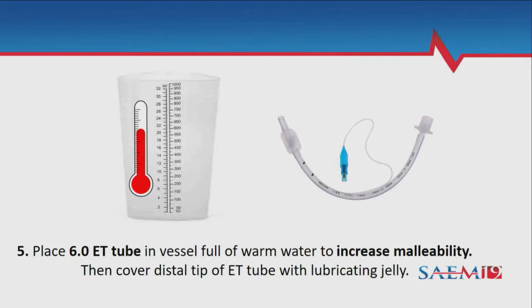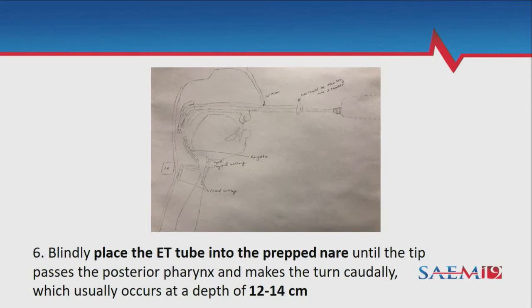Place the endotracheal tube into your prepped naris. We'll probably just dilate with our fingers, getting it as dilated as you can and pushing those turbinates out of the way. We have nasopharyngeal airways (NPAs) available, but that's just another thing going in and out of your nose. If you feel you can tolerate it, try loading the tube directly. You can feel it as you're inserting it — go, go, go, go.